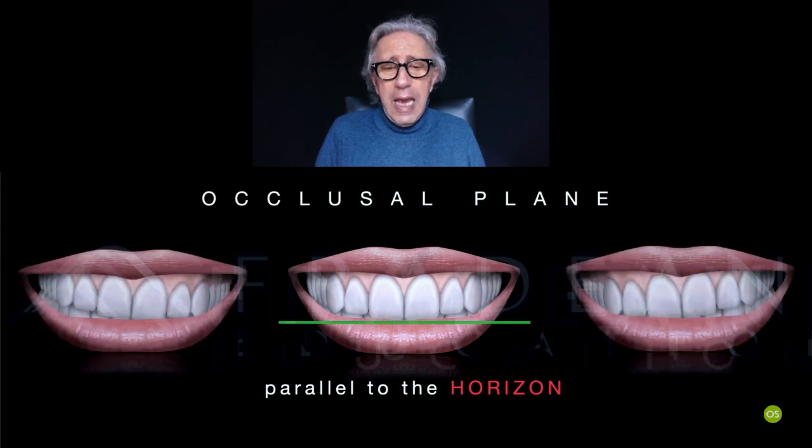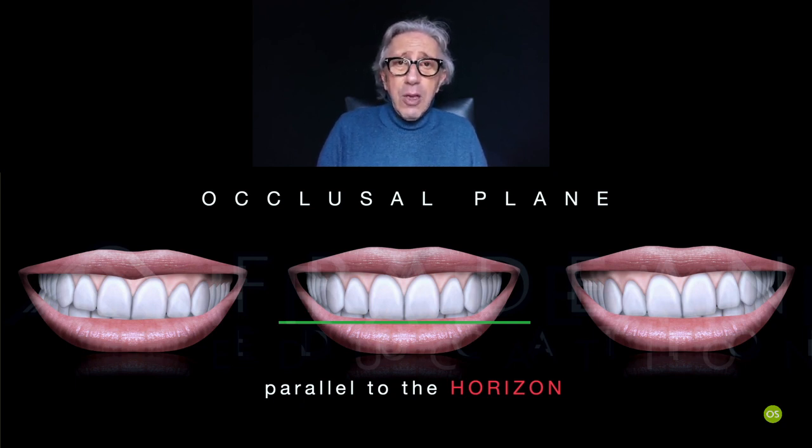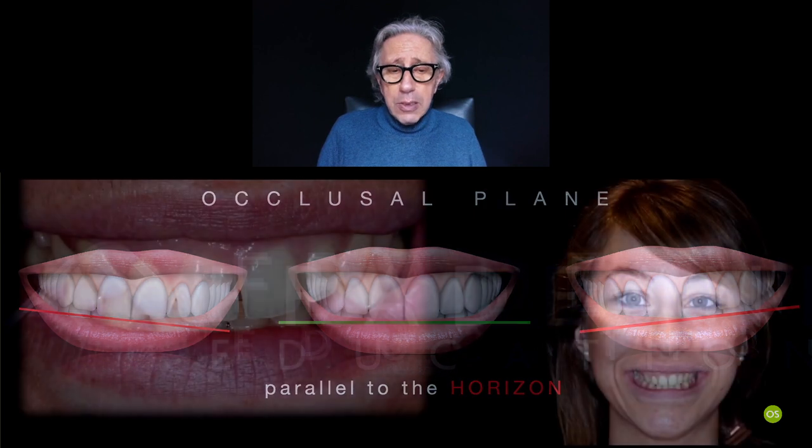It shouldn't be inclined on one side or the other side, because it starts to create miscommunication between the technician and the dentist. It is very important to catch this point and have the chance to send all the info to the dental technician in order to avoid this inclination of the occlusal plane in comparison to the horizon, to the horizontal reference line too. So that's a very important step.